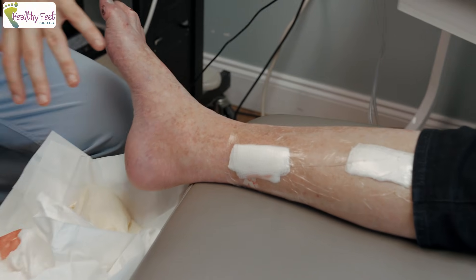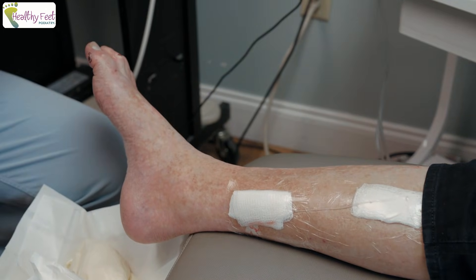How this works: the nerves themselves send stimuli to the brain to tell you there's pain, regardless of what's causing it. For this gentleman, it's neuropathy. The purpose of the stimulator is to send more of a positive signal back to the brain to say there's no pain — no pain signals being sent to the brain. It's not getting rid of the underlying cause of the neuropathy; it's basically telling the body there's no pain down here.